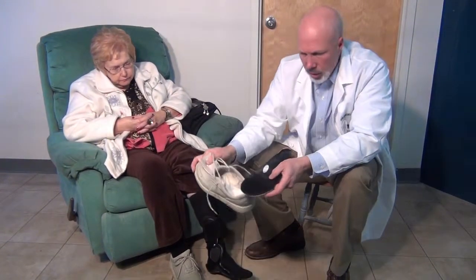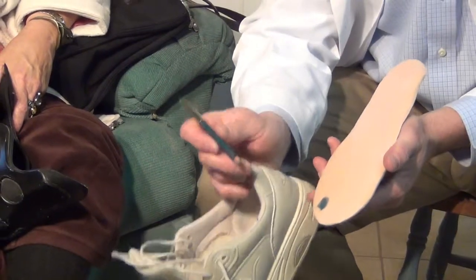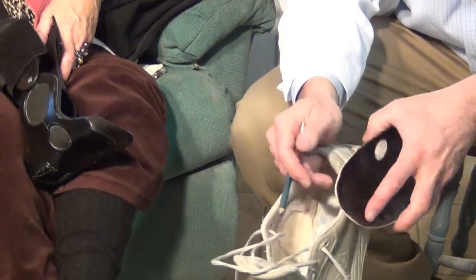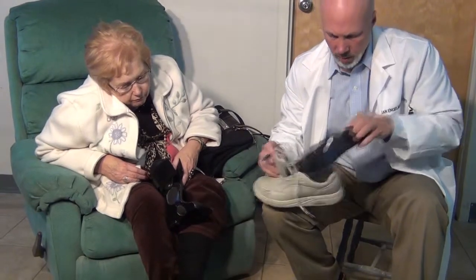So we're going to have to relieve the shoe in order to solve the problem. Inside the shoe here we'll have to make a relief. In order to find exactly the right spot, we use lipstick — or in this case an eyeliner pencil. Lipstick is really good because it's red and it's gloppy. We color the spot that's right underneath the high pressure spot, then insert this into the shoe and press down a little bit. Then we have a mark from which we can make our relief.